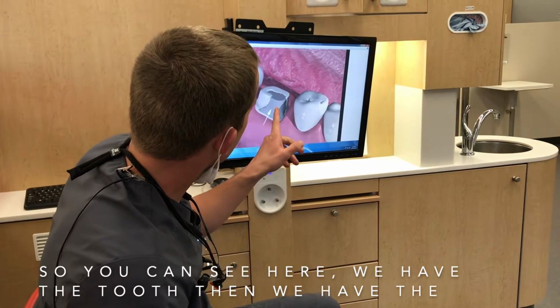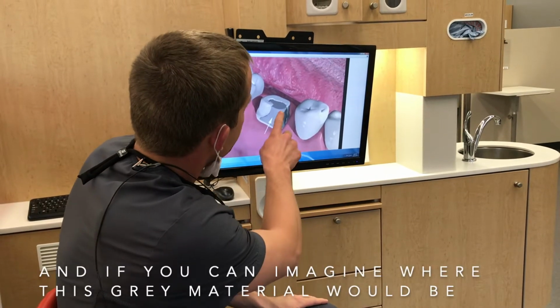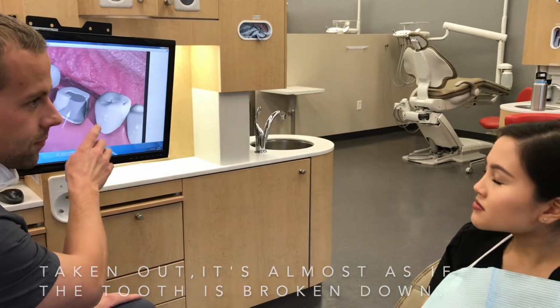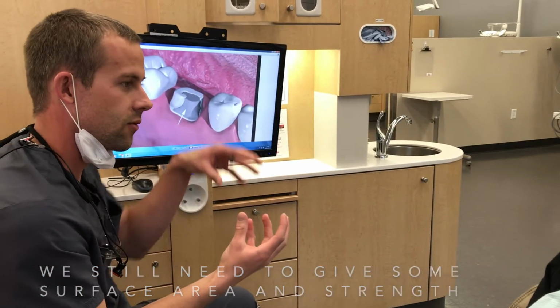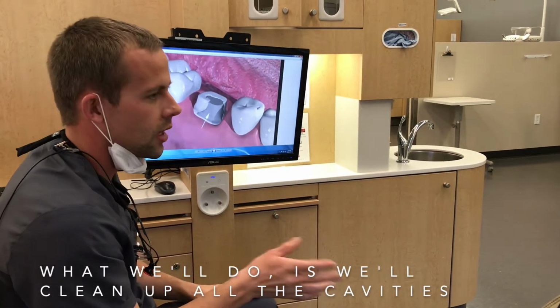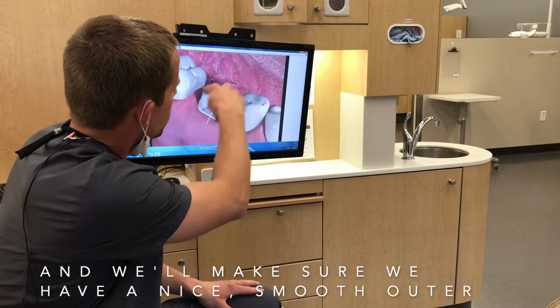So you can see here, we have the tooth and then we kind of have this gray material. And if you can imagine where this gray material would be taken out, it's almost as if the tooth is broken down. And so when a tooth is really broken down, we still need to give some surface area and strength for the crown to sit on. So in your case, what we'll do is we'll clean up all the cavities and we'll make sure we have a nice, smooth outer rim.